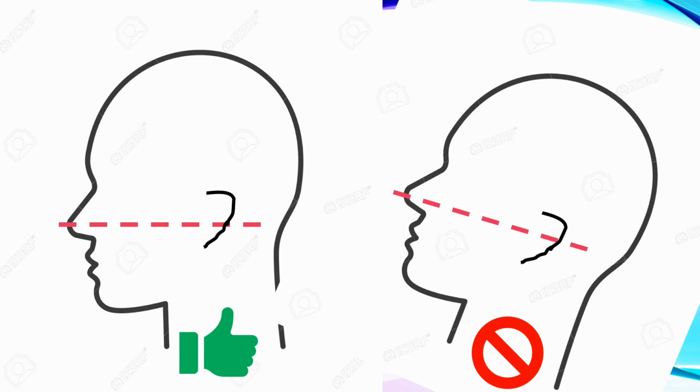You can see that the nose and the ear, or the occlusal plane of the mouth, is parallel to the floor. So you also need to have the tooth and the film or the sensor parallel with each other, hence the name, the paralleling technique. If the patient has a shallow palate or tori, or if they are a gagger, this technique might not be feasible. So it doesn't work on every single patient, but otherwise, this is the quickest and easiest technique.